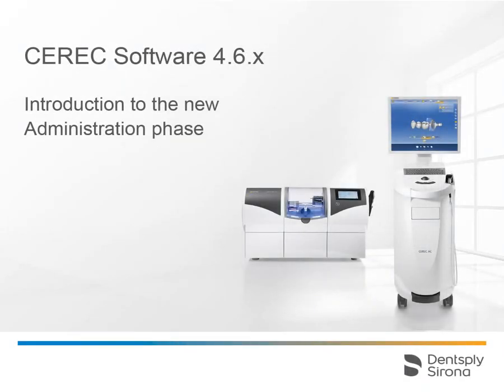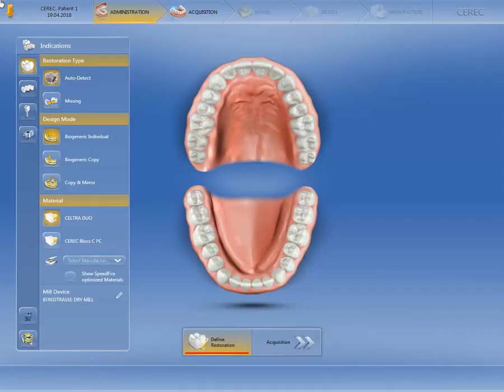Welcome to this video tutorial introducing the new administration phase. Once you have filled in the patient data, you reach the administration phase.